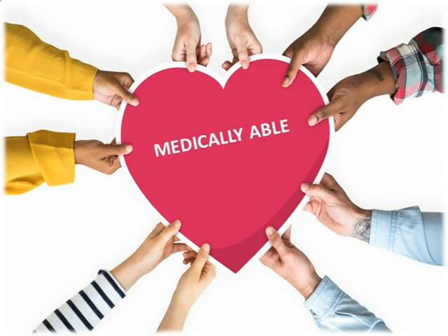Each healthcare worker who is required to use a respirator must, first of all, be medically able to use the device. What do we mean by medically able? By medically able, it means there is no healthcare concern that would prevent a person from using a respirator. Some conditions that would prevent a person from using a respirator include heart conditions, lung disease, and psychological conditions like claustrophobia.